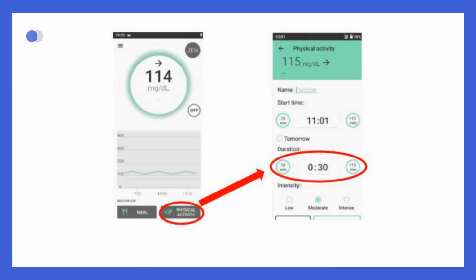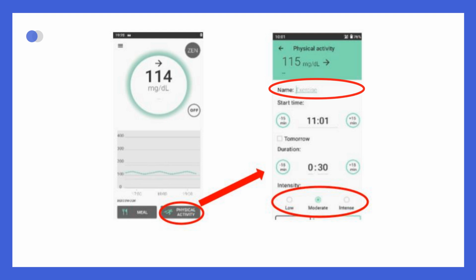The duration of this mode is adjustable within a 0 to 24-hour range. After the activity, the DBLG1 algorithm will slowly lower the target value back to the normal target glucose level. The type and intensity of the physical activity impacts the degree of aggressiveness reduction around physical activity.